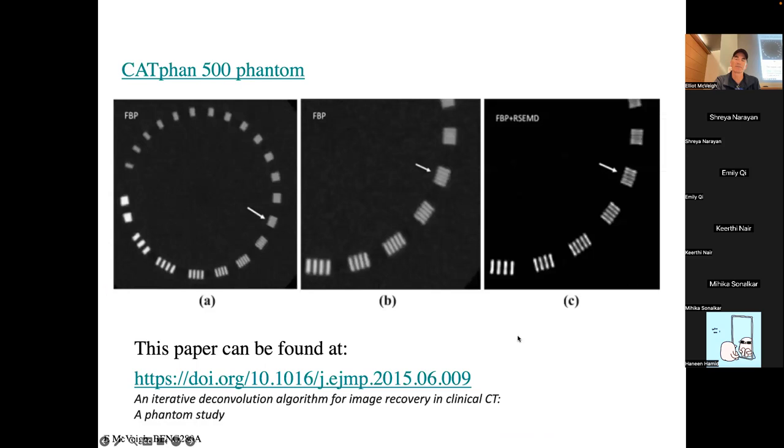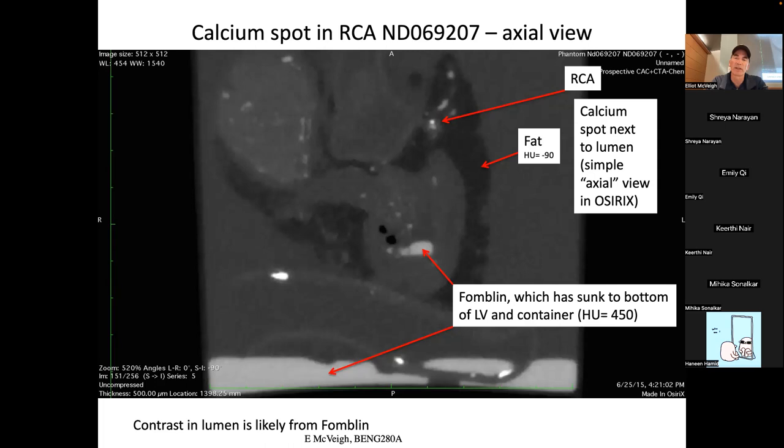Some examples of actual resolution in action: here is a human heart in a jar, and this is a coronary artery. The artery lumen is visible with contrast agent, with the vessel wall shown nearby.